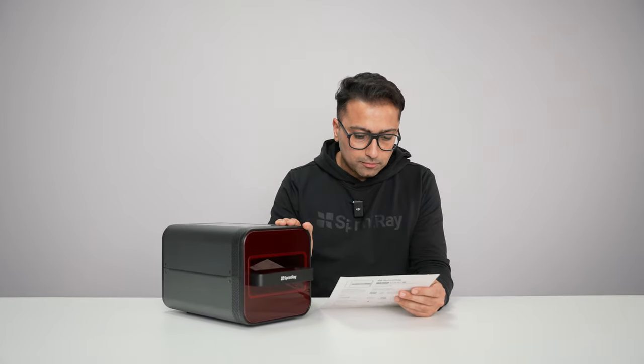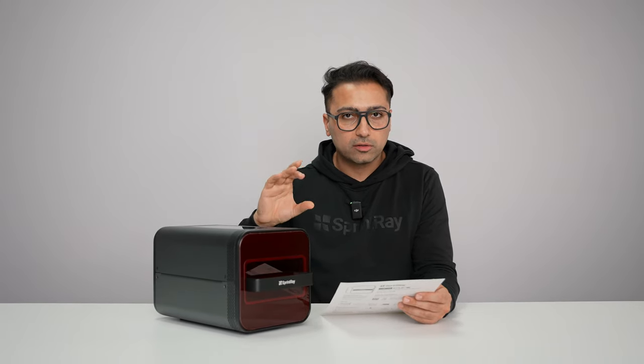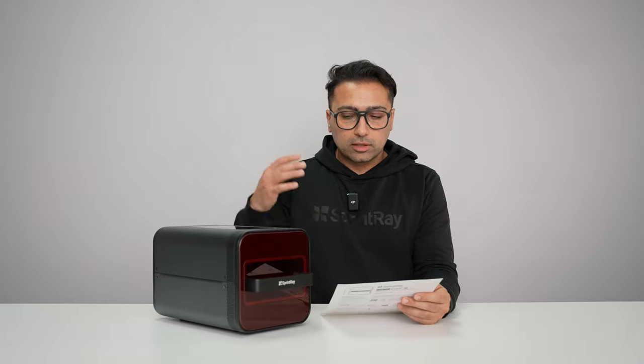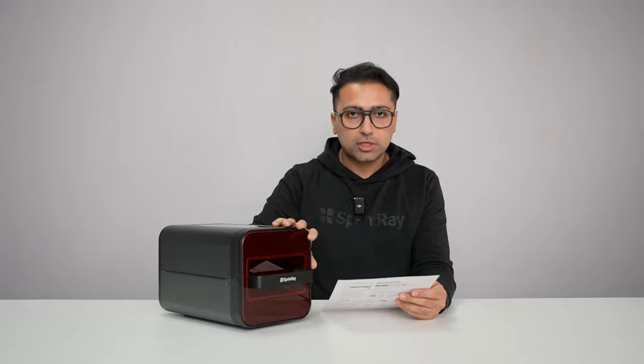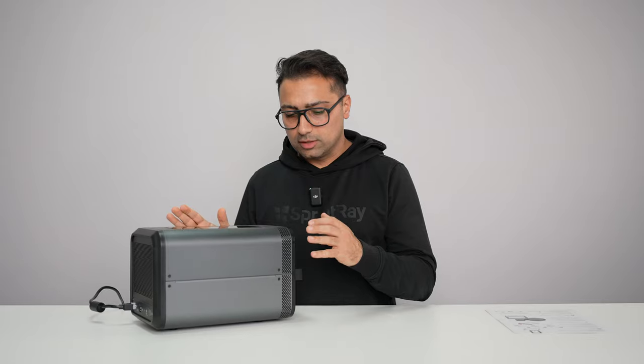We installed the curing tray already. Just make sure that your parts — in terms of height — are limited to three inches. If you have a bigger part, you may need the bigger curing machine. Most dental parts are going to fit right into this. This machine can take up to four full-arch size models, which is more than enough for most practices. Let's get going — let's start using the NanoCure.